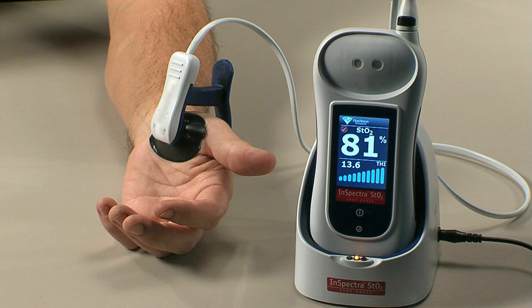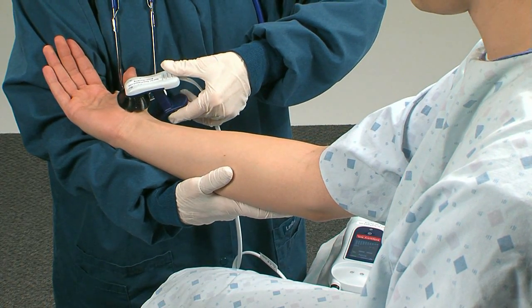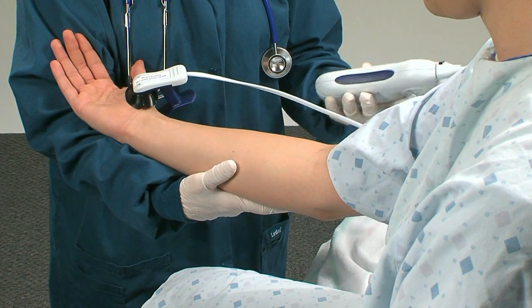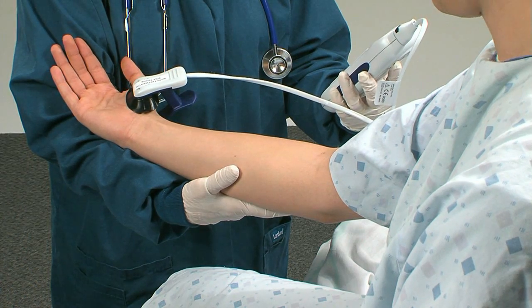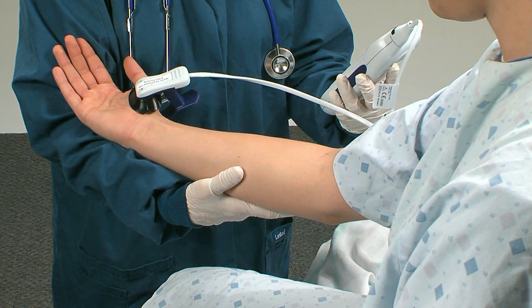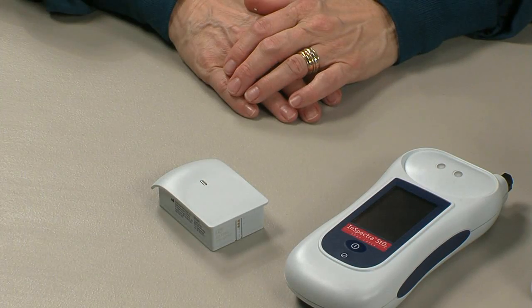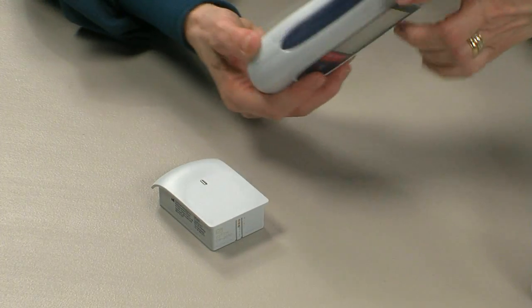The InSpectra STO2 SpotCheck is intended for use as a non-invasive monitoring system that measures an approximated value of percent hemoglobin oxygen saturation in thenar skeletal muscle tissue. It is indicated for use in monitoring patients during circulatory or perfusion examination or when there is a suspicion of compromised circulation of thenar skeletal muscle.